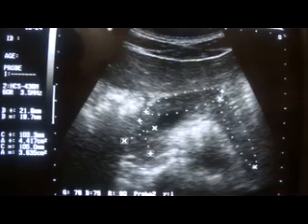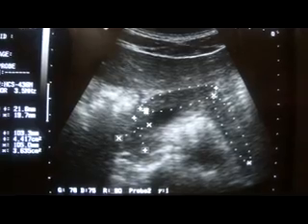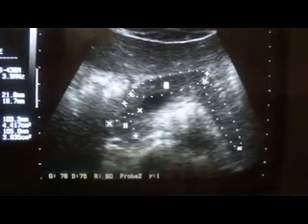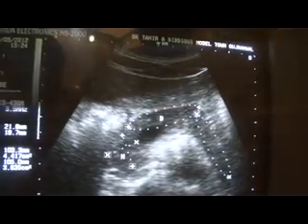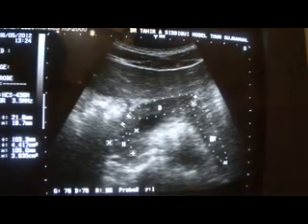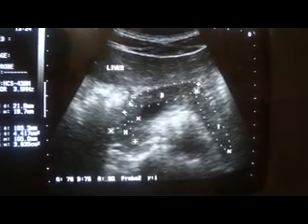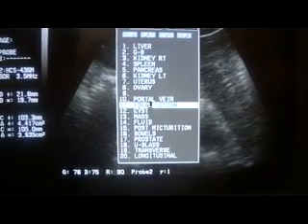And I think if you go on practicing on normal patients as much as possible with the angles and scanning plans that I have provided you, I don't think you will need any academy to pay a lot of money and learn the normal ultrasound, because once you understand the normal, there will be no issue for you to pick the anomaly as you place the probe on the desired part of the pathology you are looking for.